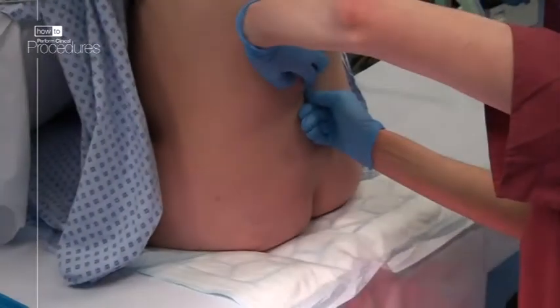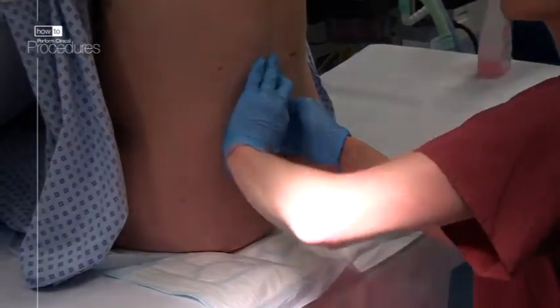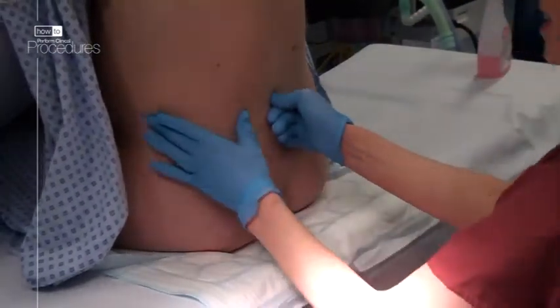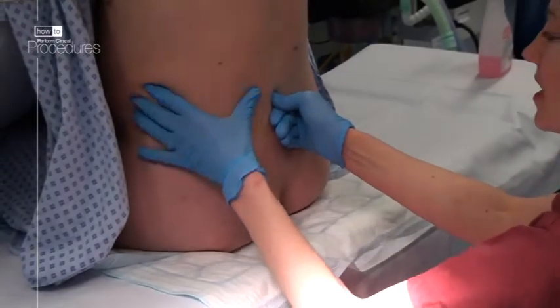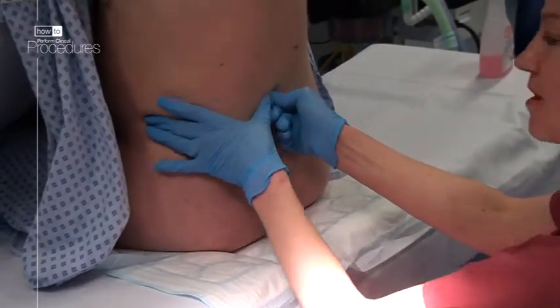Remember, the spinal cord ends at L1. If you go in at the L3-4 interspace, you will meet only the cauda equina, which will push out of the way of your needle.